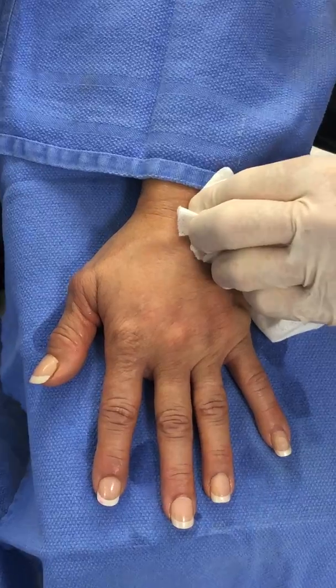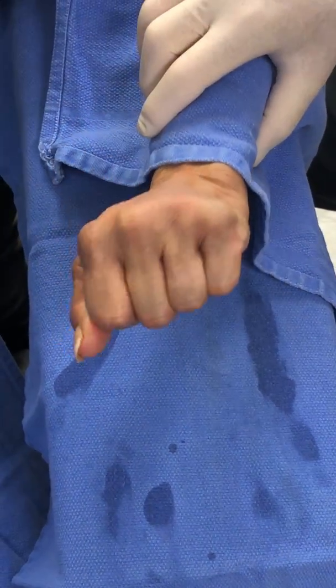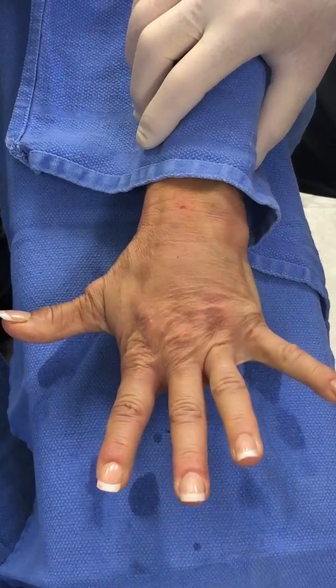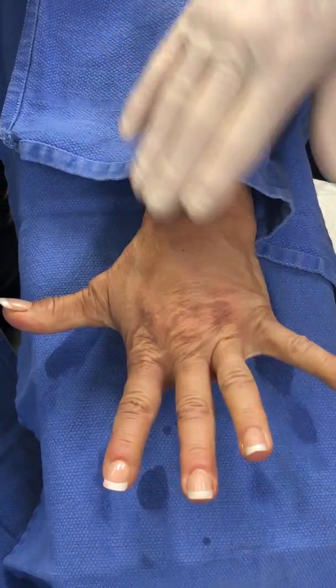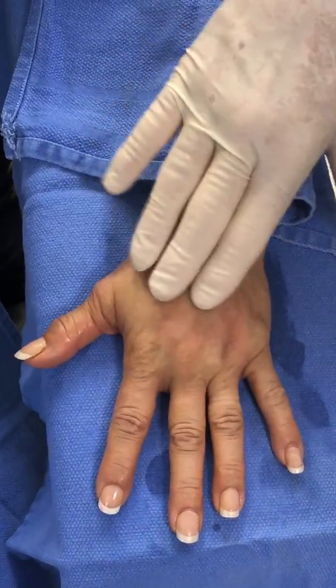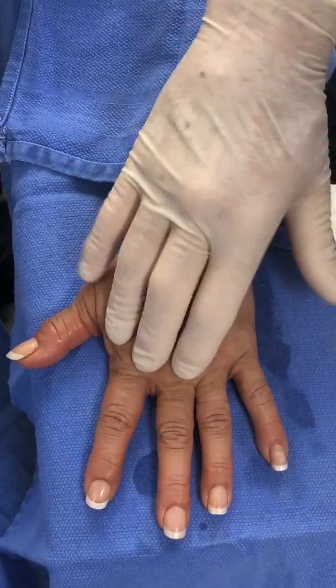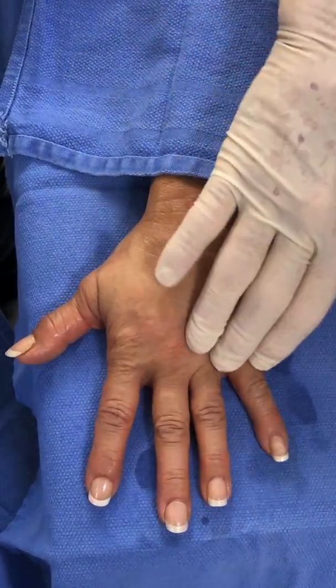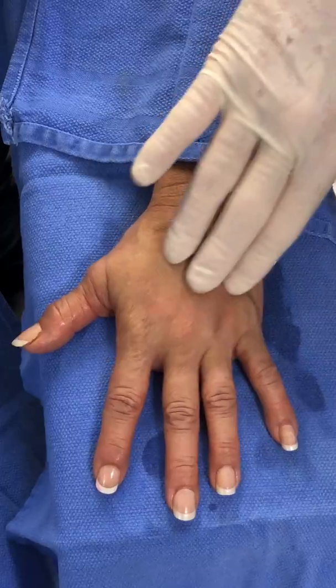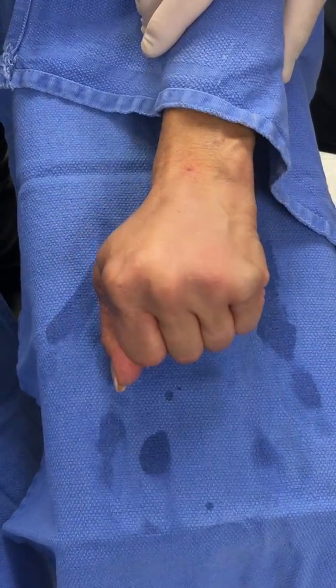So we finished with that hand. Now lift your hand up, Bonnie. Make a fist. Open. Make a fist. Open. Let me just gently massage that around. Go ahead and make a fist again, three times.